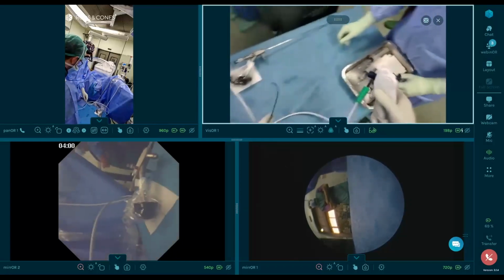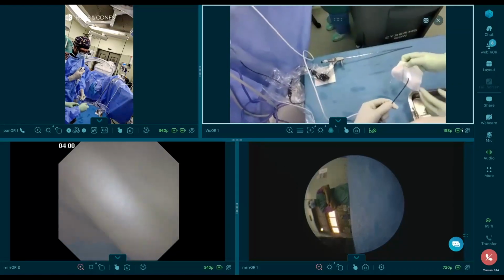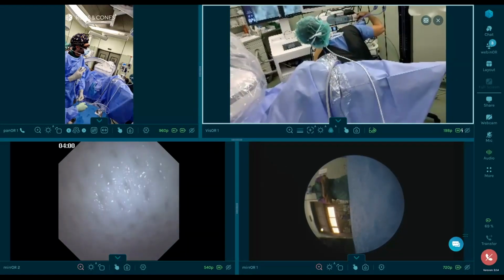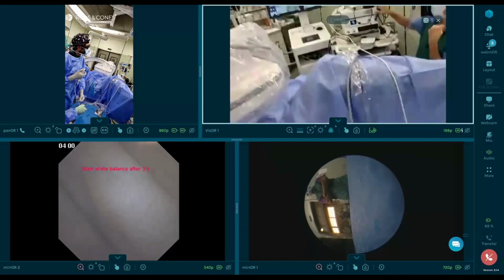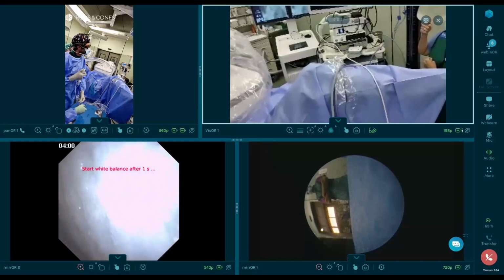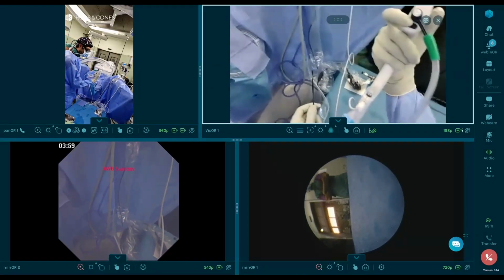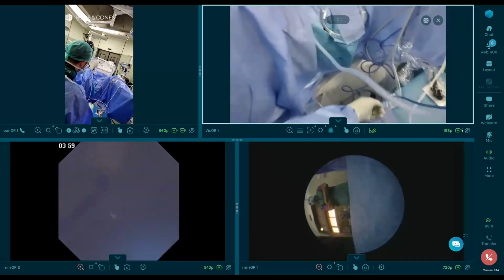So I'm going to put the ureteroscope in my whole screen. Me das una gasa, por favor. And I'm going to do white balance. ¿Me haces un balance de blancos, por favor? Remember, you have to do white balance. Three seconds with the button, perfect. Three seconds of this first button that you have here in the scope, and you have the white balance.